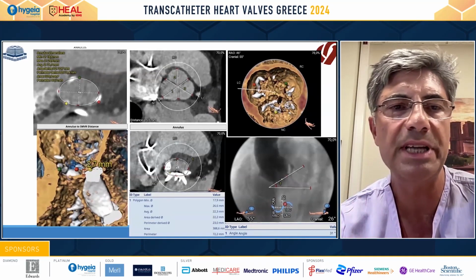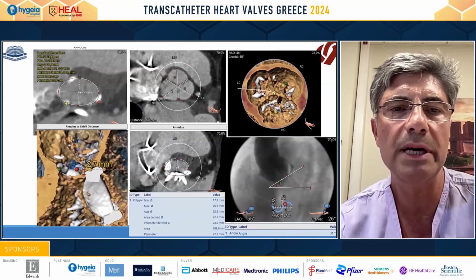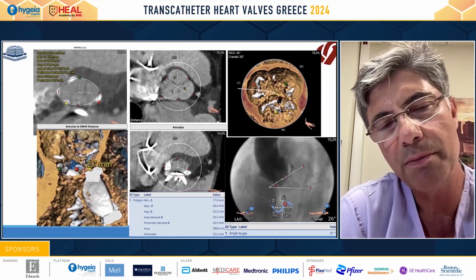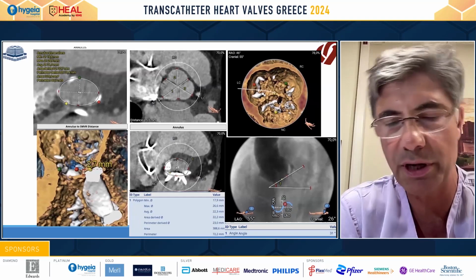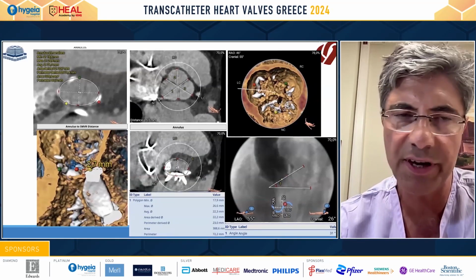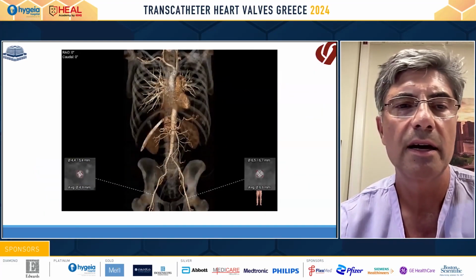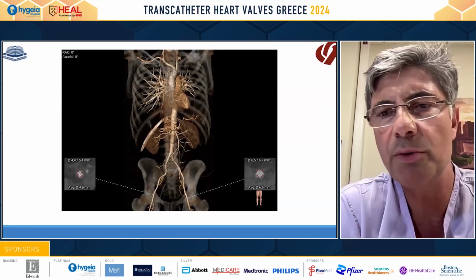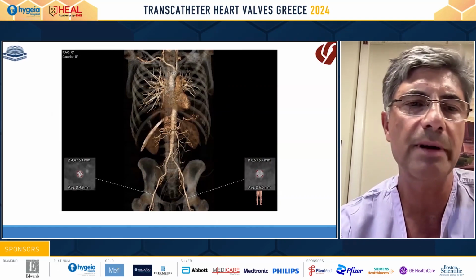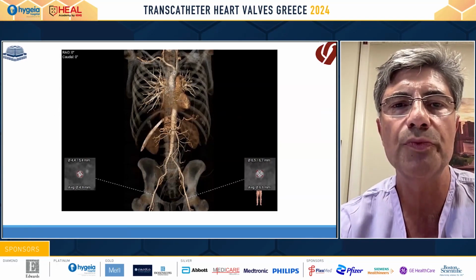And also you can appreciate the mitral aortic annulus angle, which is 31 degrees, and there's a very small distance, less than 3 millimeters, between the annulus and the mitral valve, the aortic mitral distance, which we know for the Edwards we need to have 3 millimeters, and for CoreValve we need to have 4 at least. The femorals were unimpressive, maybe on the smallest side from the right femoral, but there are no extensive calcifications, so it's something that we can do via the transfemoral approach.